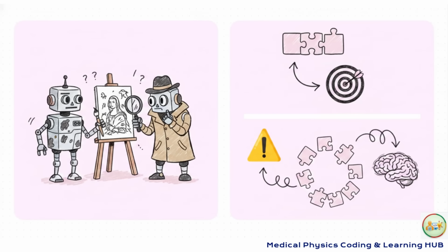But honestly, GAN training can be pretty unstable. CycleGAN gets around the paired data problem by using a clever trick called cycle consistency loss. This is a game changer for hospitals that just don't have perfectly aligned scans. The limitation, though, is that without that paired grounding, there's a higher risk of the model basically hallucinating anatomical inaccuracies.